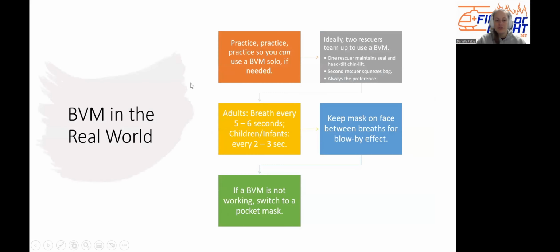Okay, now using a BVM in the real world, so I'm kind of referencing this based on what I teach my EMT students. Many of you may have had this experience where you're an EMT student in the class, and part of the testing, at least here in Montana, is that you have to be able to use a BVM by yourself, completely solo. So throughout the class, we practice it, we make sure you can use a BVM by yourself. And that's kind of all we really talk about. We really stick to that.